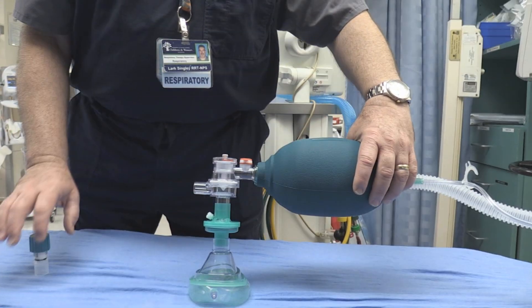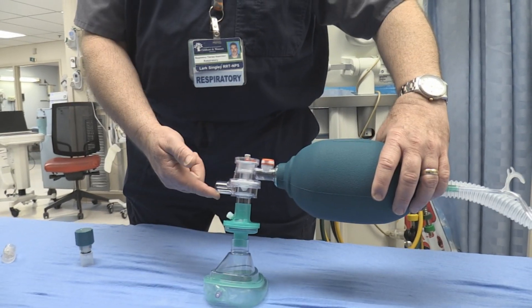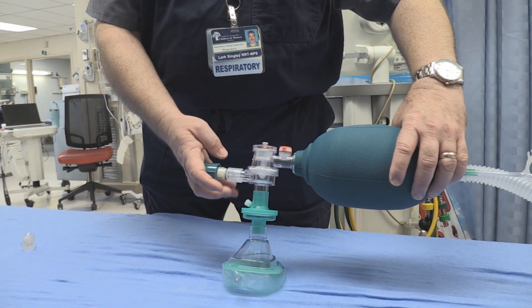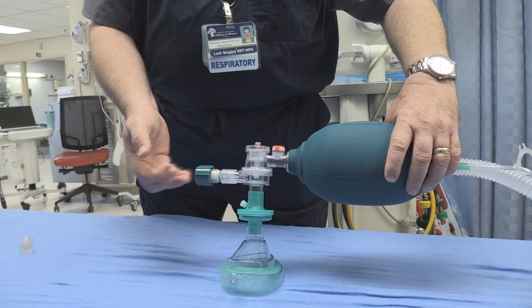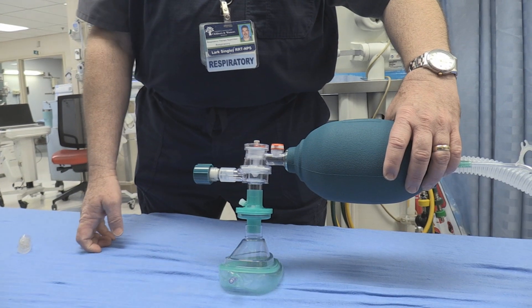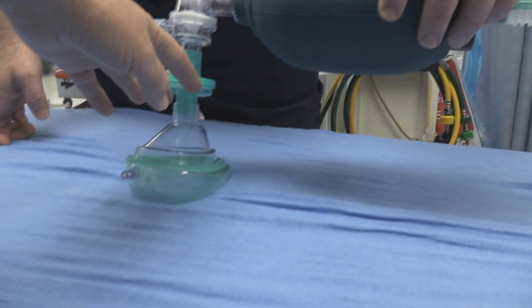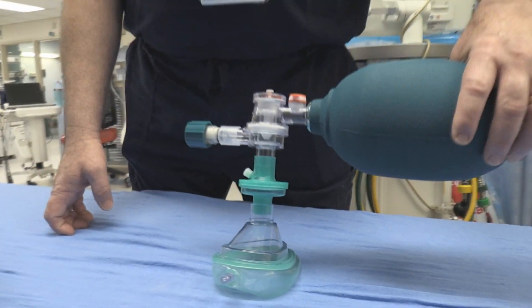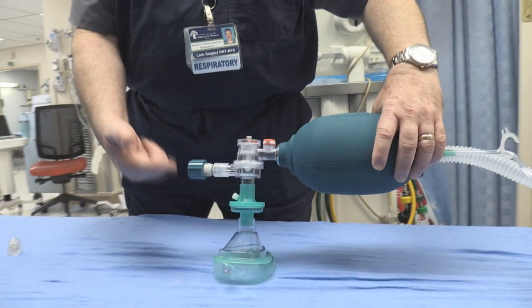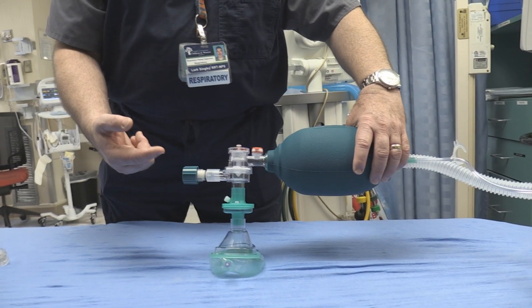Without the PEEP valve there is a possibility that air can be pulled back in through the exhalation port — not a whole lot, but there's still that possibility. By adding the PEEP valve, even set at zero, this creates a one-way valve effect so that no air or gas is being entrained from the room. And as long as you have that filter in this position, you're filtering both inspiratory and expiratory gas.